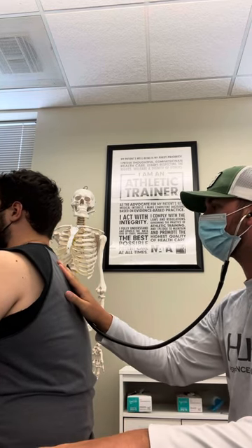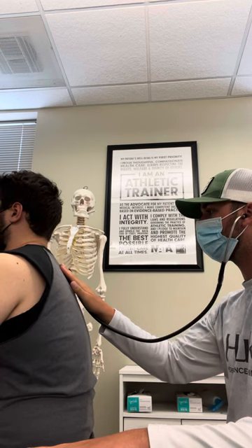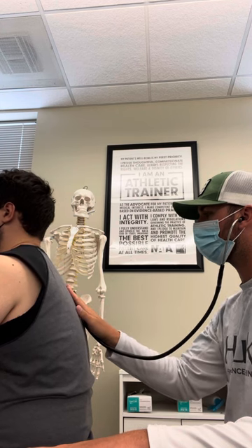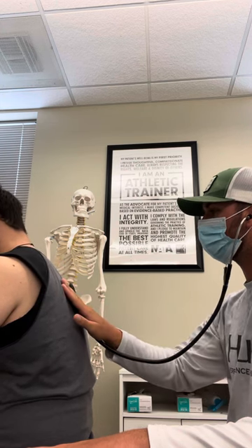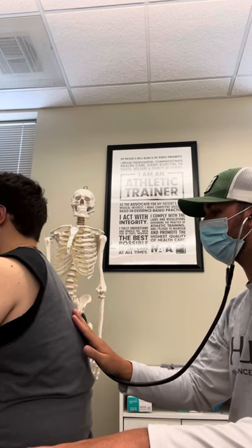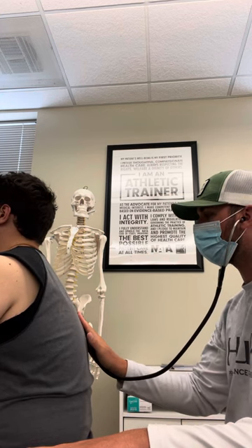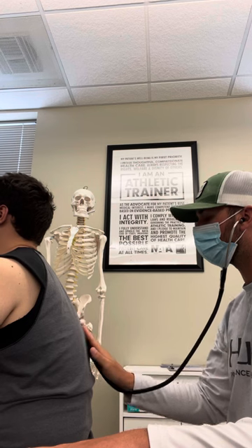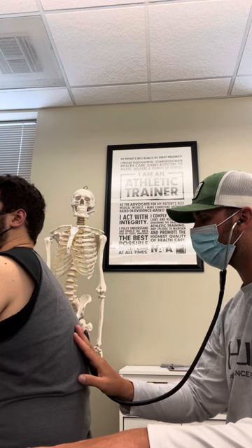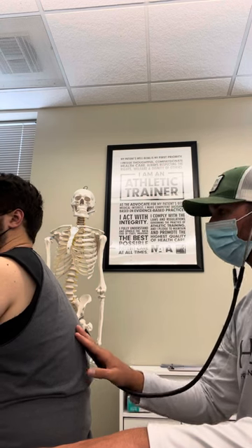Go ahead and breathe normal. Go ahead and breathe. All right, go ahead and face me now.